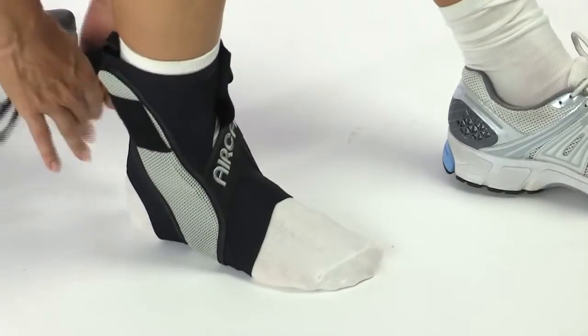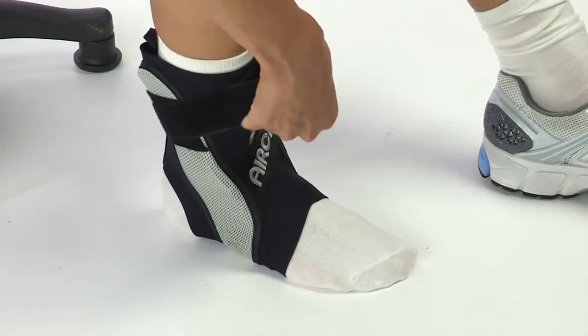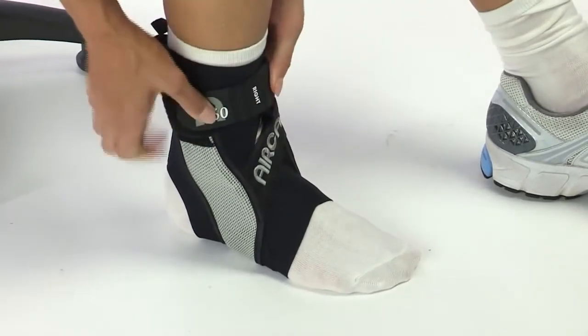With its convenient, simple, single-strap application, the A60 eliminates time-consuming lacing and the cost and hassle of repetitive taping.